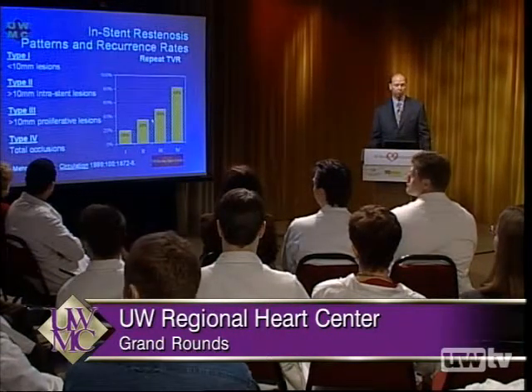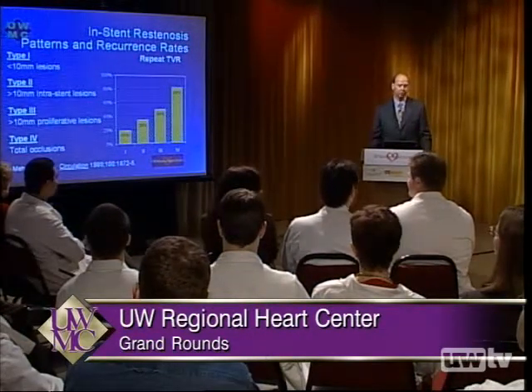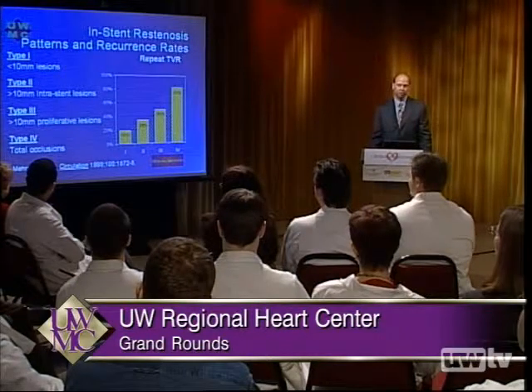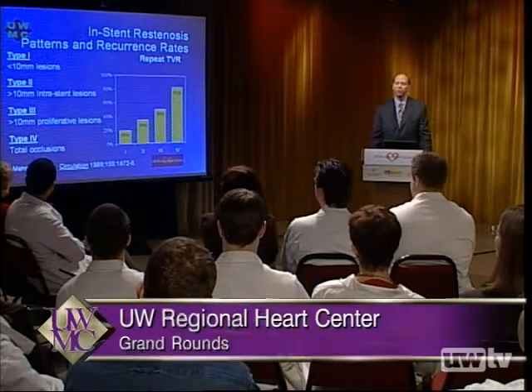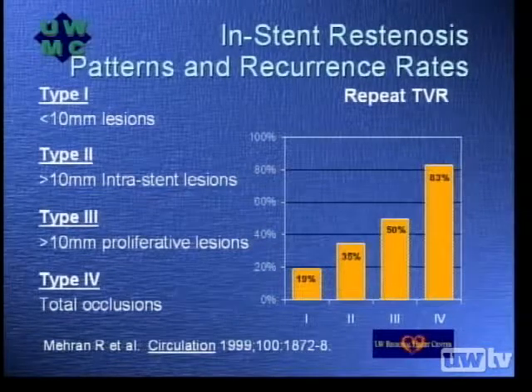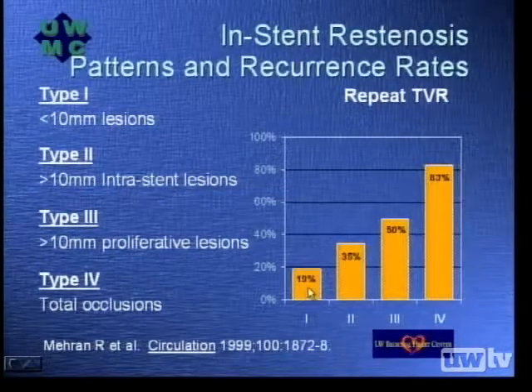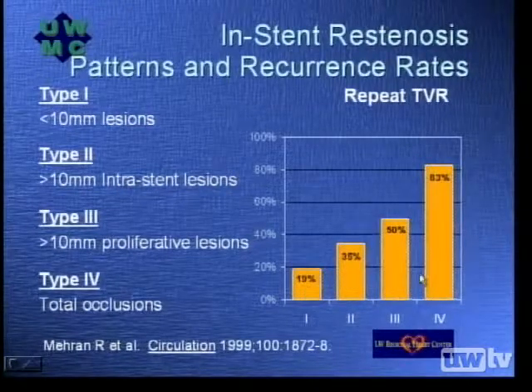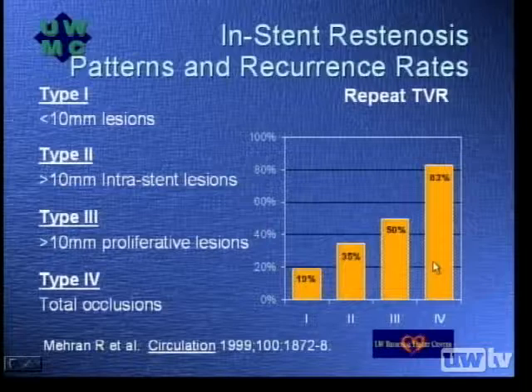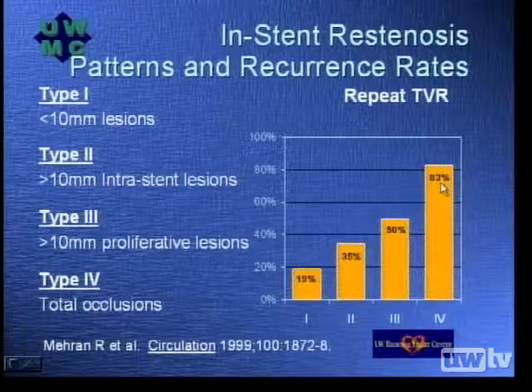And just to show one of those factors, it has to do not only with the length of stents placed, the type of lesion that is present to begin with, the length of the lesion, and several other factors. It also has to do to a great extent on what type of restenotic process that you see in the stent. So if you have a situation where the restenotic portion is very focal, then the chance of restenosis is quite low. However, if you have a stent that's completely occluded and you're successful in opening that back up, then your restenosis rates approach 80%. So this has a profound impact on subsequent restenosis, just the lesion itself that is seen at the time of repeat angiography.